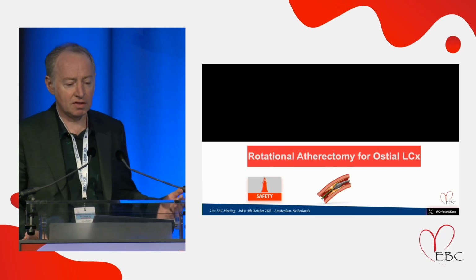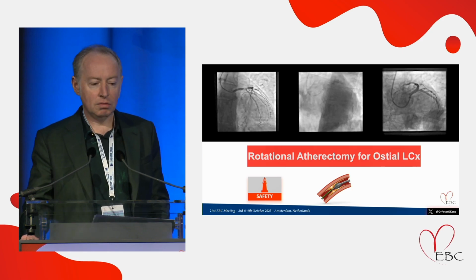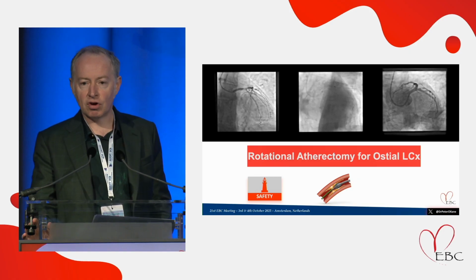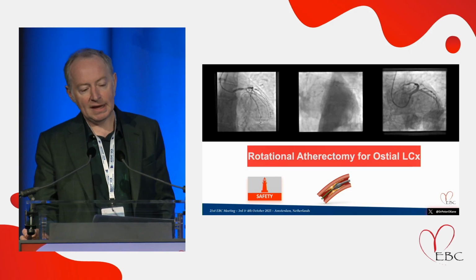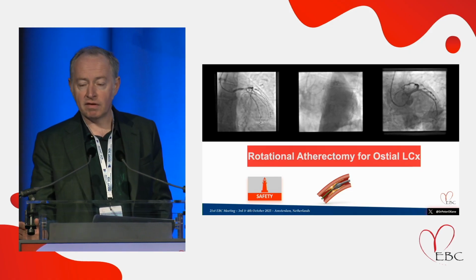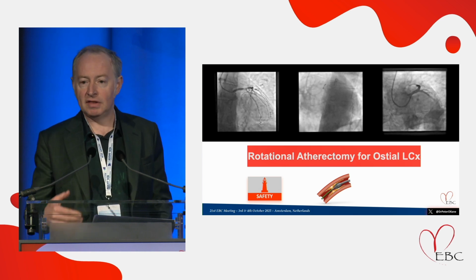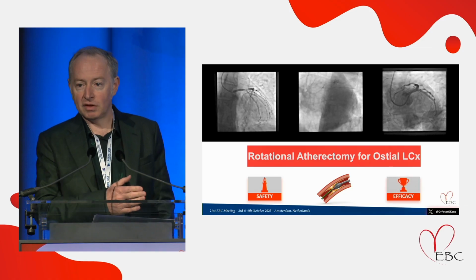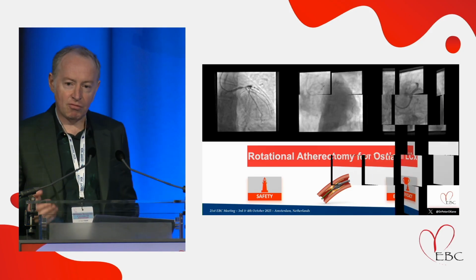So rotational atherectomy then. It's been around for 30 years. You know, we're using it still a lot in our practice. It is very safe, but we have to recognize that there are complications, and I'll go through some of those potential hazards a bit later. But it does work. It works very effectively, and we shouldn't shy away from it. We need to maintain our skills, and we need to keep teaching people how to use it, because, you know, obviously with other technologies like IVL, this technology is threatened, and we need to keep practicing it because there is a learning curve.